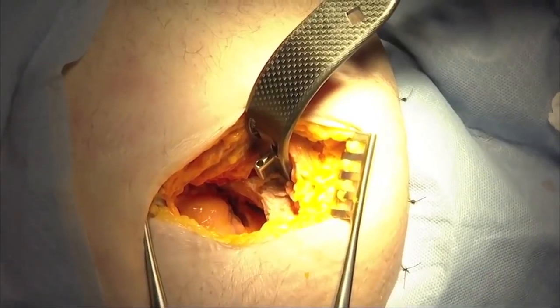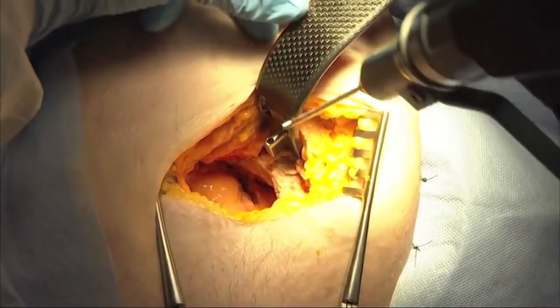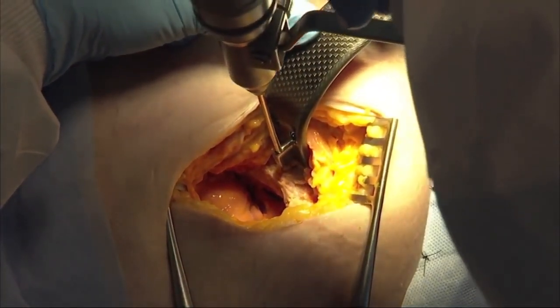We're still medial to the acetabulum, and so what we're going to do, as you saw, is put the wire in safely, medial to the acetabulum, that will hold the retractor in place.